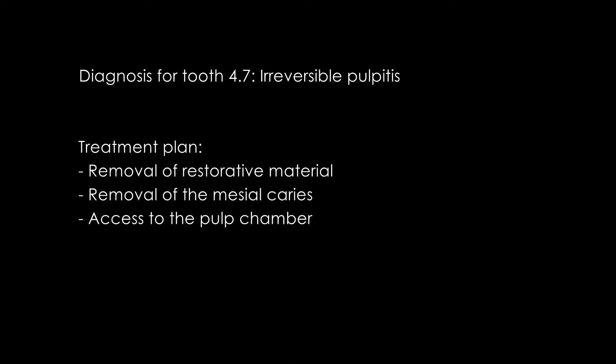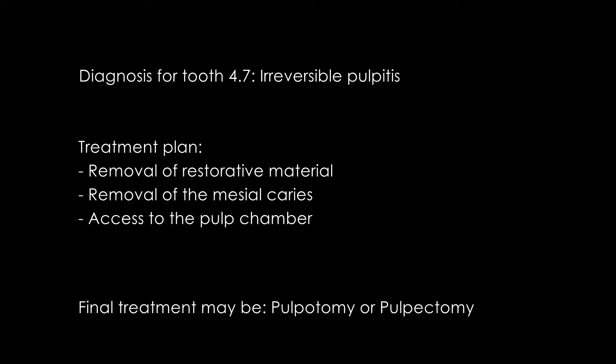The treatment plan encompasses removal of the existing restoration and of the mesial caries, and access to the pulp chamber. The patient is advised that, depending on the status of the pulp in the chamber, the final treatment may consist of a pulpotomy or a pulpectomy procedure.